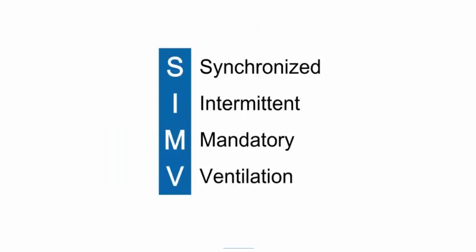SIMV modes. SIMV stands for Synchronized Intermittent Mandatory Ventilation. They are among the most frequently used modes. SIMV modes evolved from IMV modes, intermittent mandatory ventilation, and almost replaced them completely.